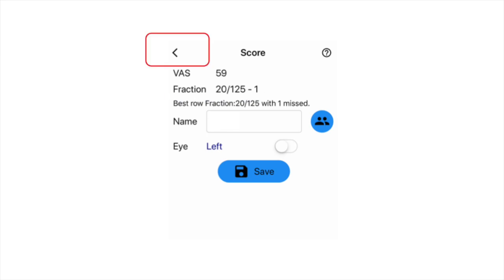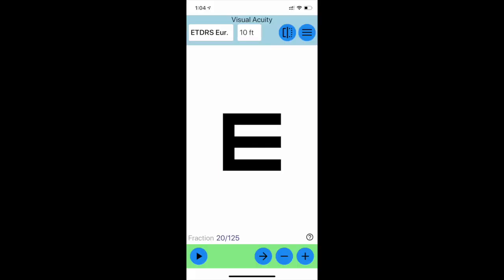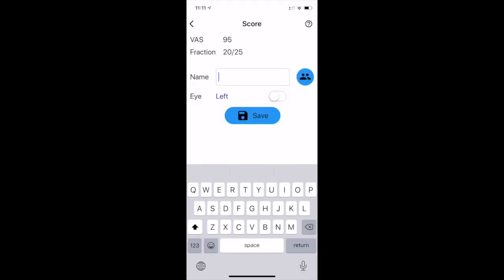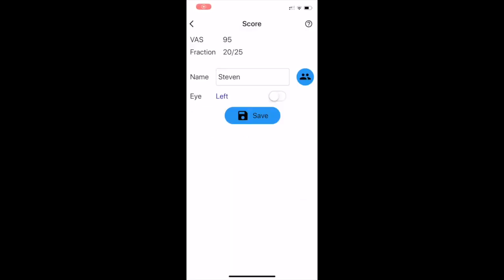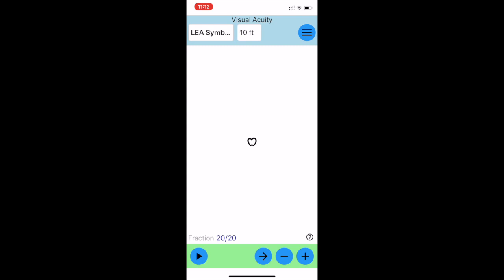To test each eye individually, press the top left arrow. Once you return to the main screen, reset the chart by pressing the plus button until it goes gray. After testing the left eye first, enter your child's name in the score sheet, then press save. Make a note of the VAS. After testing the right eye, press the button to change the left eye to the right eye in the score sheet, and press save. Make a note of the VAS.